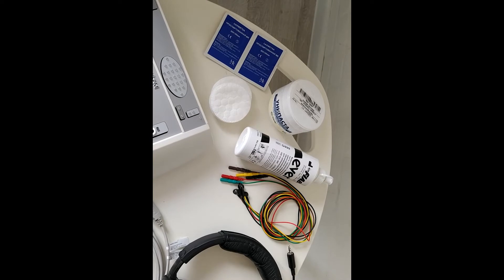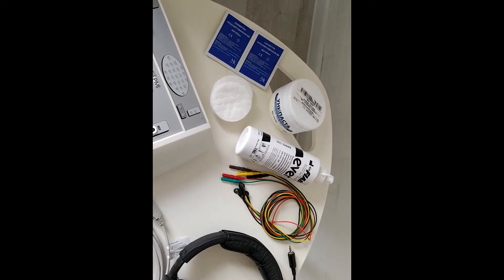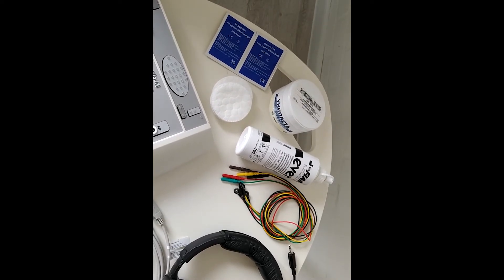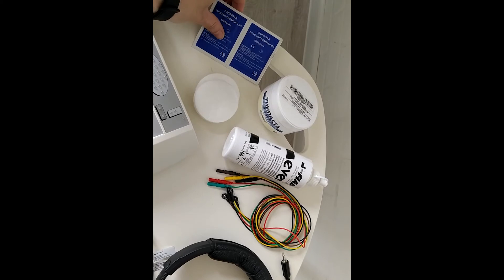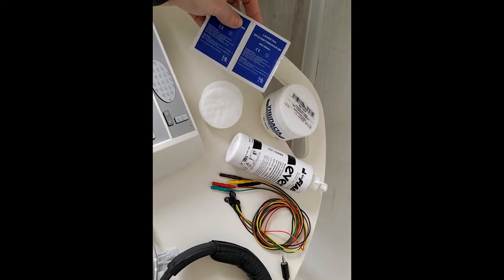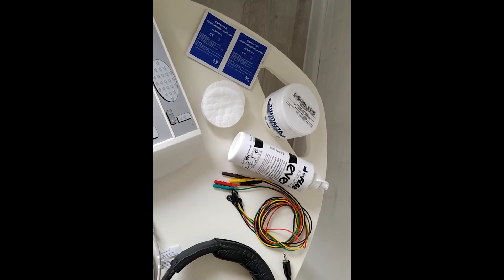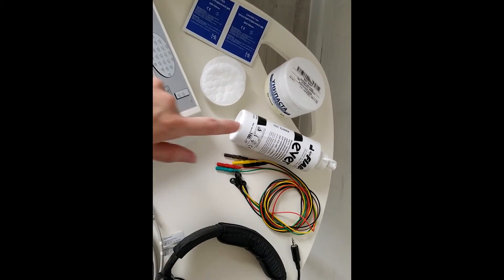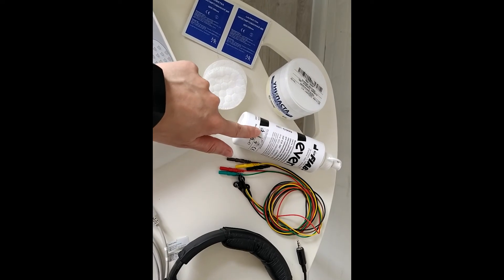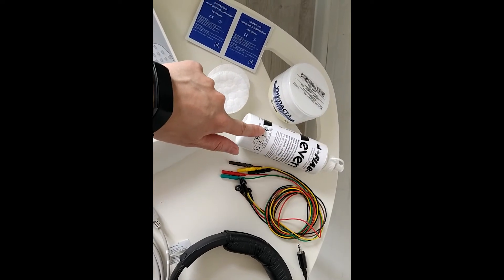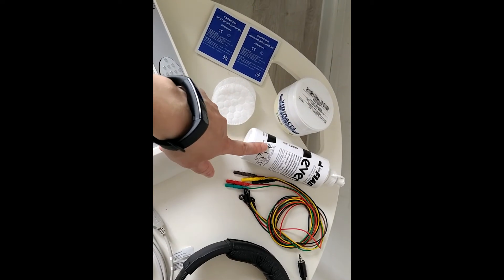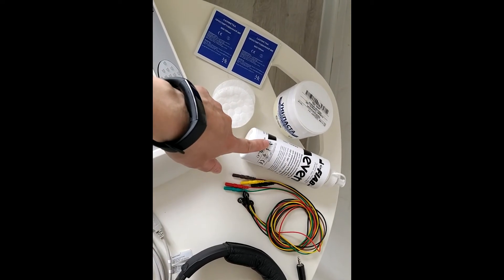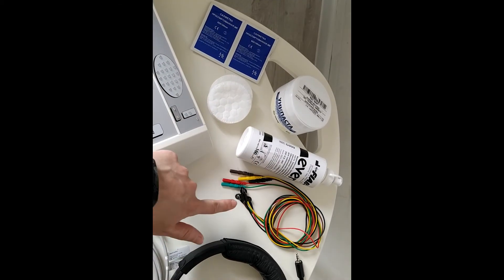We need to prepare the skin on the head properly. In the first step, we use the Spiritus napkin to degrease the skin. After that, we use the abrasive paste and rub the skin gently till slightly redness.